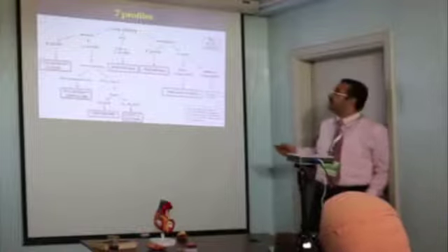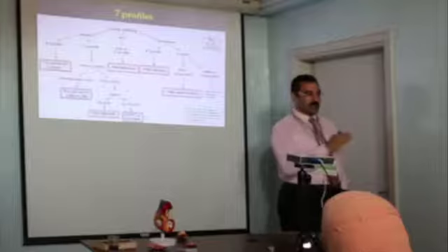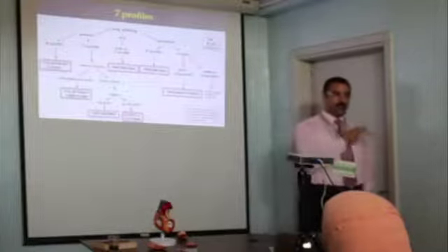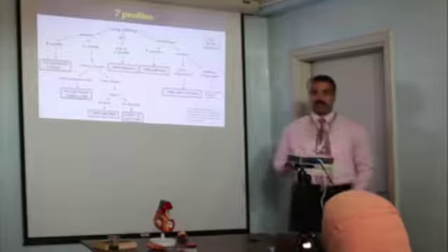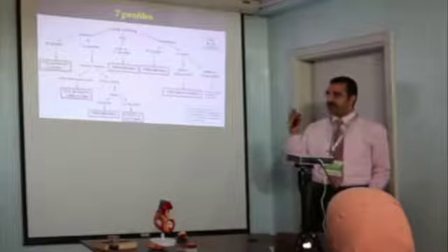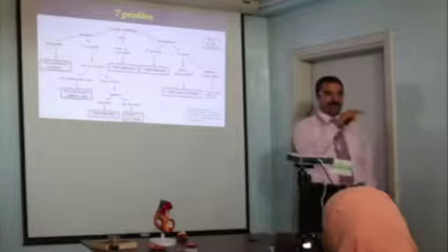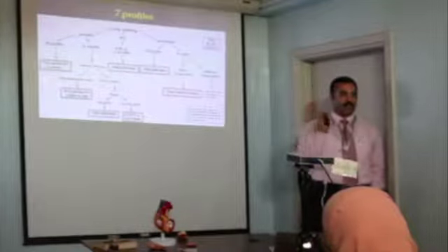But this is again back to assessing lung sliding. If you can see good lung sliding, I go to the next step, which is either A profile or B profile. If it's B profile, which is multiple B lines, more than three, just homogeneous B lines, bilaterally the same, this is an indicator of pulmonary edema. Homogeneous, bilateral, nothing more. This is just pulmonary edema. If there is any extra finding in the back, it is a change in the diagnosis. So pulmonary edema is B lines with positive lung sliding, and these are the only findings you have.